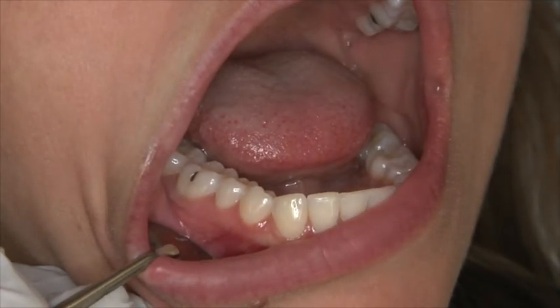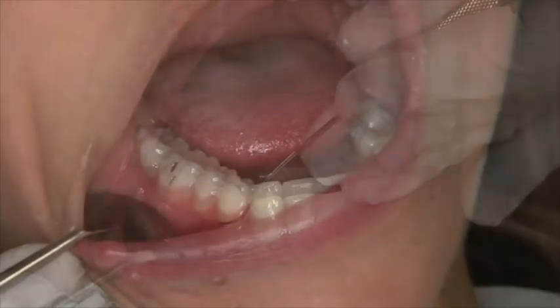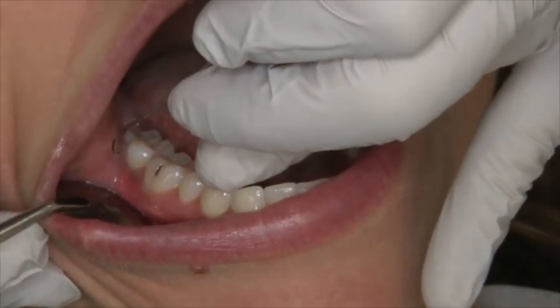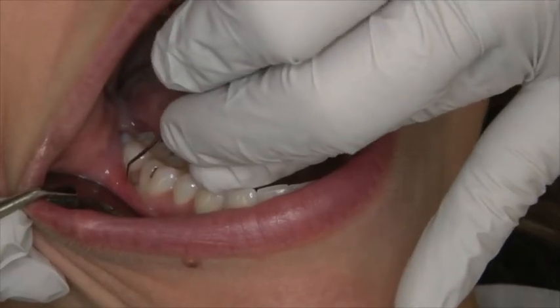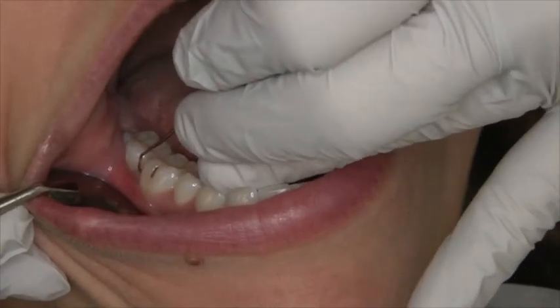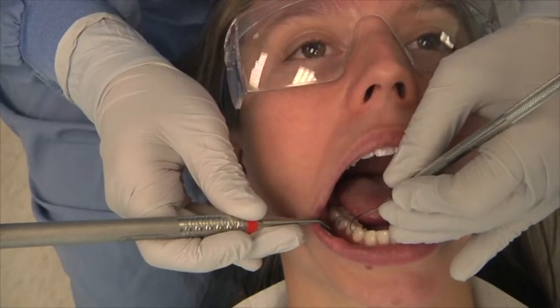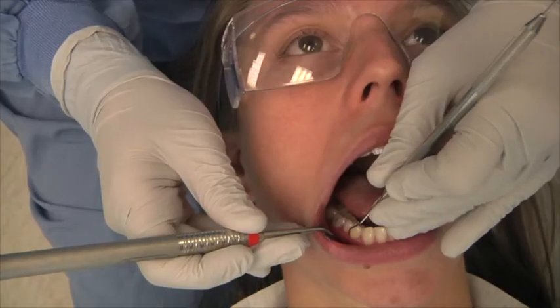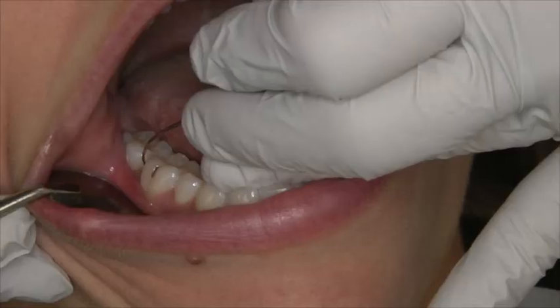Once the appropriate end has been determined, establish a stable fulcrum on a tooth near the area being instrumented. Insert one to two millimeters of the side of the tip of the Explorer at the distal line angle of the most posterior tooth. Using an exploratory stroke, advance the instrument distally. Oblique and vertical strokes should be used to explore between the gingival margin and junctional epithelium into the distal interproximal area.